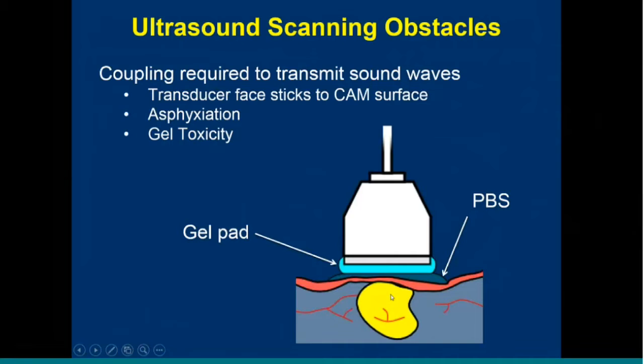The tissues of interest for the CAM are really, really close to the surface, and so you want to get a bit of a window here, a bit of a standoff, just to push it into that focal zone.